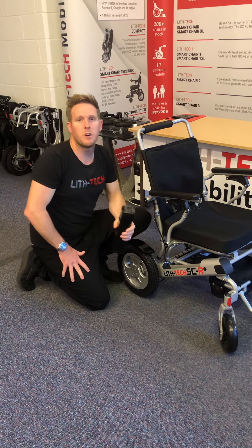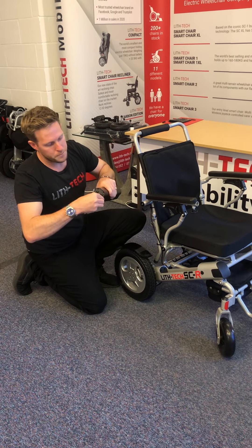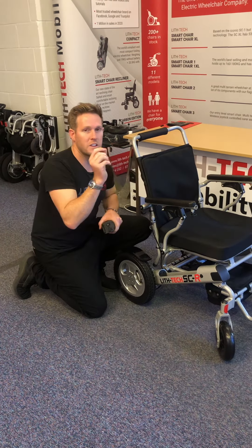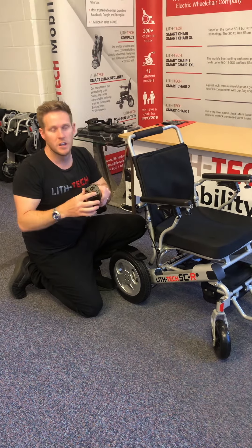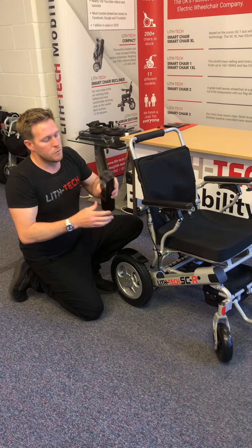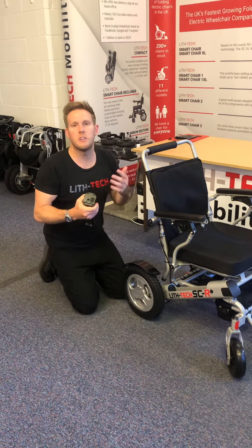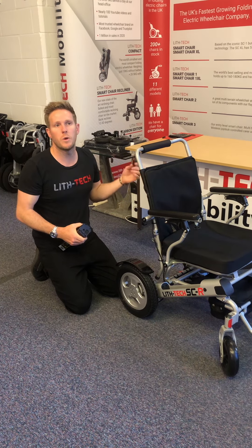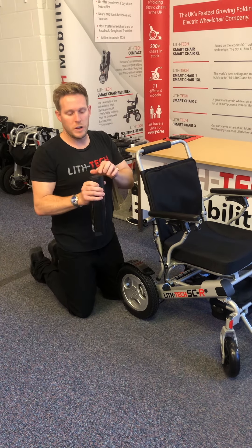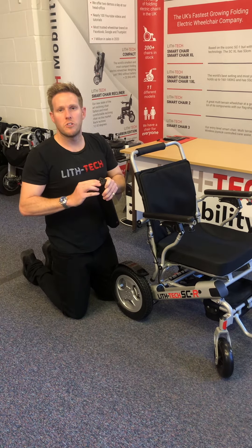If you do want to charge your batteries off the chair — for example if you like to keep the chair in the boot of the car, or when you're on holiday and want to charge in your hotel room — there's a little portal you can charge directly into. The new charger on this chair uses exactly the same charger lead for the joystick as for the battery portal, so there are no adapters — it's literally one charger lead suitable for both. At the end of the battery there's also a USB port. It's not really for charging your phone regularly, but if your phone runs out of battery and you're stuck somewhere and need to call a taxi, as long as you've got your USB lead you can charge your phone straight through the battery for emergency calls. Not something you'd use every day, but quite a nice touch for when you need it.